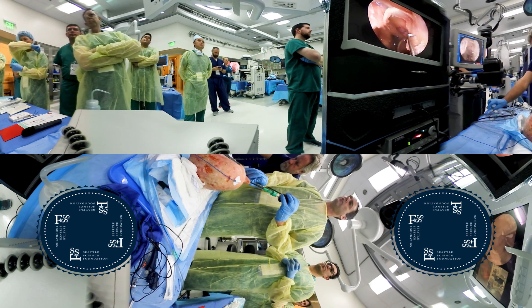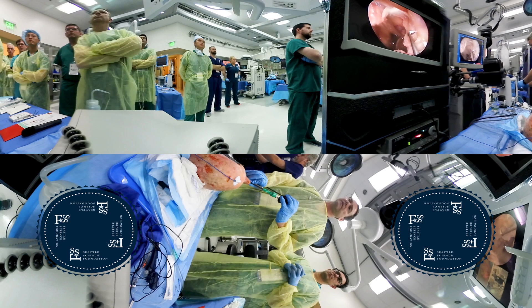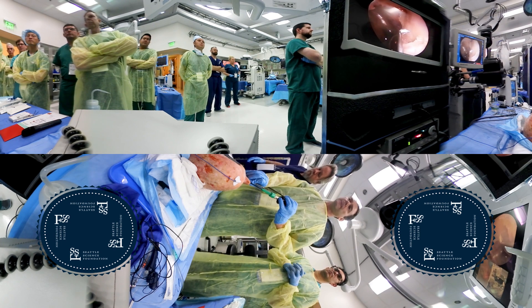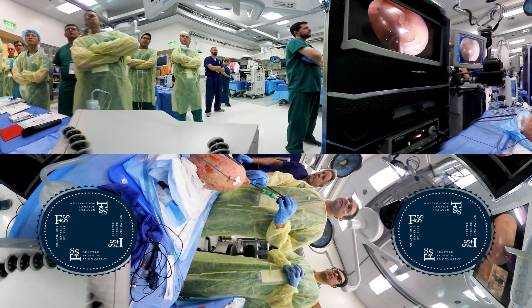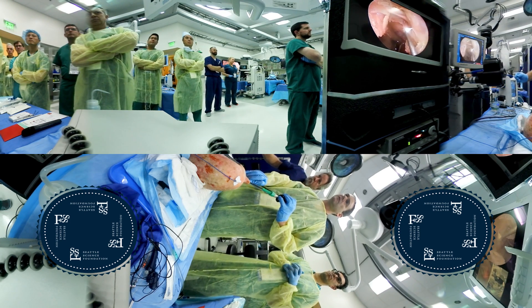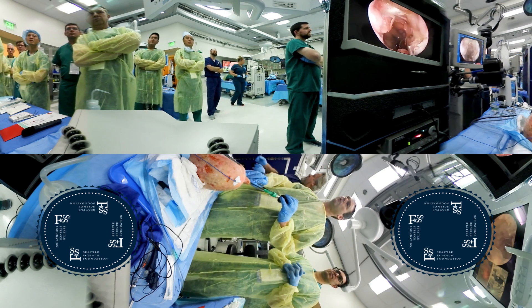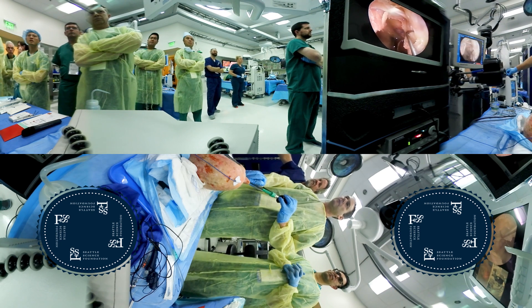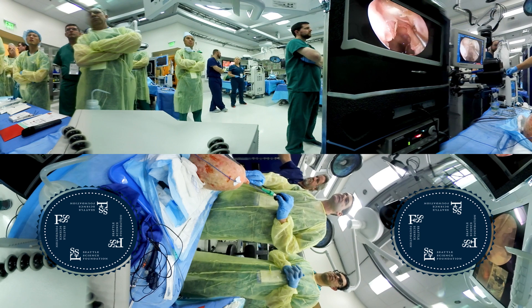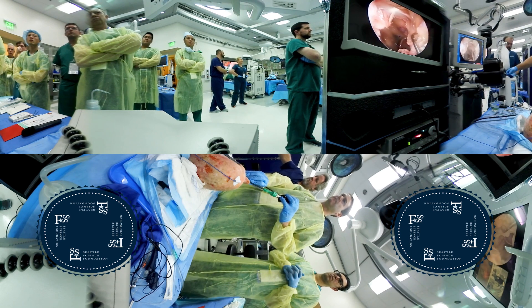When you come through with the spear knife, think about what you know — it's just like shooting a gun: you want to know your background and what your target is behind it. You don't want to pass point and hit the medial rectus, which in thyroid eye disease is really close. Also, don't put the spear knife right back next to the bone because we're going to bring in a U-shaped knife and you won't be able to get it in. Come in just a couple millimeters in front and use the tip. This is a classic University of Washington knife — usually dull but it worked fine here. We'll cut like that, then bring in a sickle knife and continue to tent this periorbit towards me. I'm not diving into the orbit — I'm pulling it out towards me, staying up nice and high, then we'll come back and do it down low.